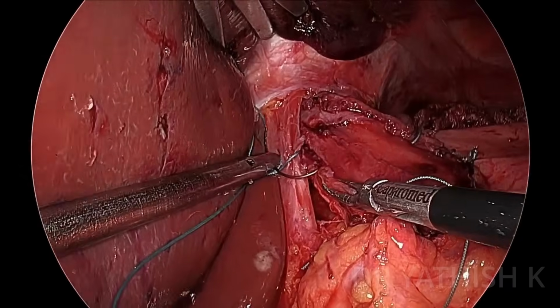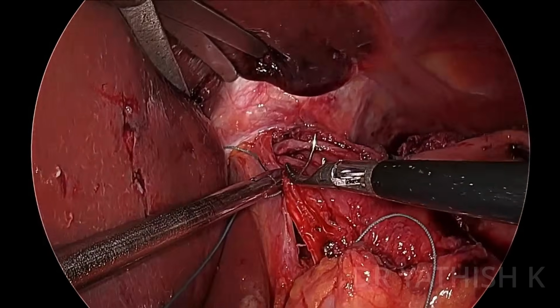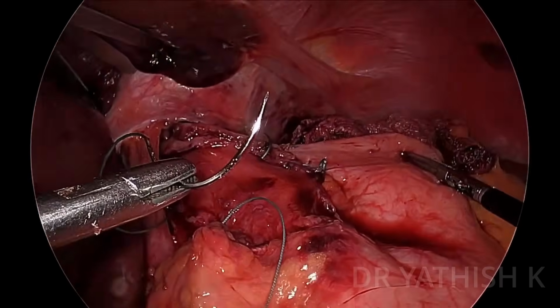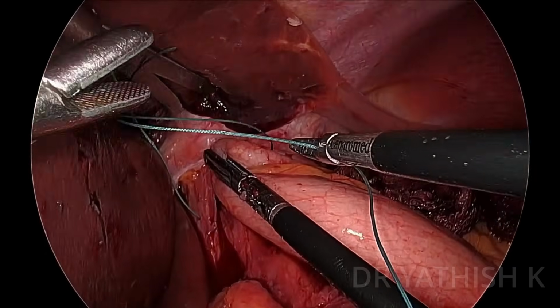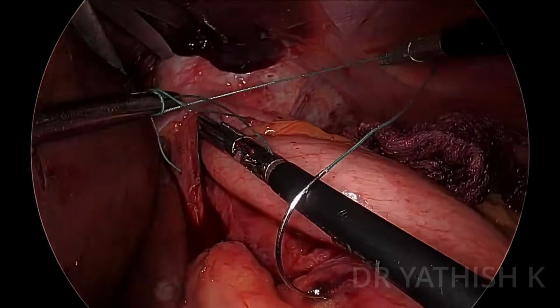Take a bite on the right crus, then on the musculature which you have divided on the right side of the esophagus. Then this time we're going to make a wrap, so we take a bite on the extreme part of the fundus. You see? So that is the extreme lateral limit of the fundus. So this will create an anterior wrap.